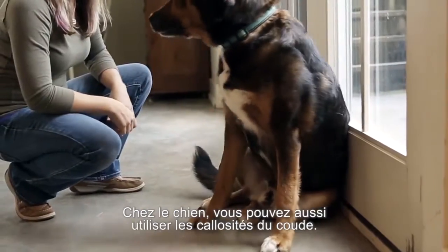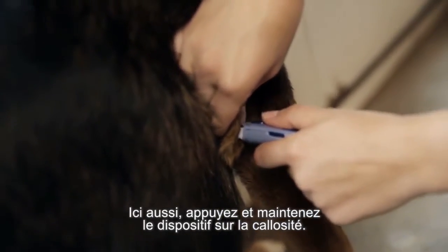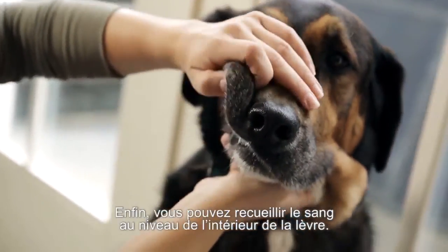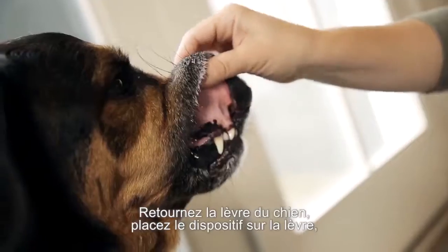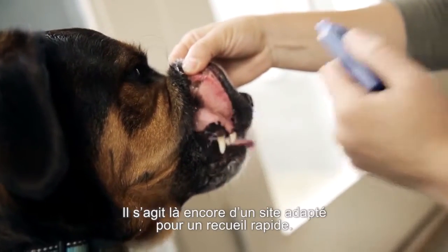In dogs, you can also use the elbow callus. Press and hold to the callus to get an easy sample. Finally, you can get a capillary sample from the inner lip. Hold the dog's lip out, press and hold the lancing device to the inner lip and release the button. Again, another good place to get a quick sample.